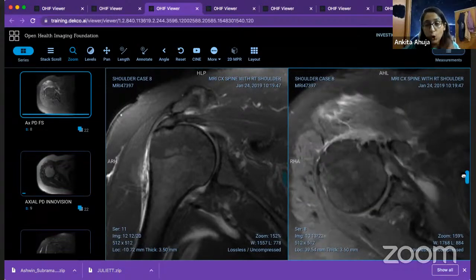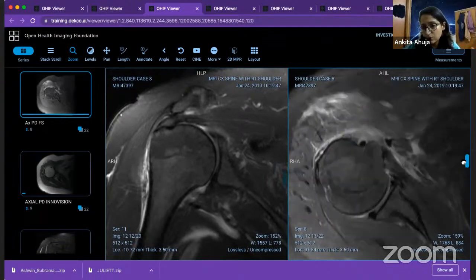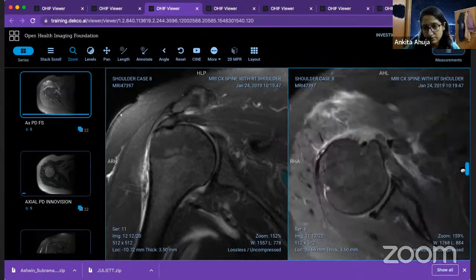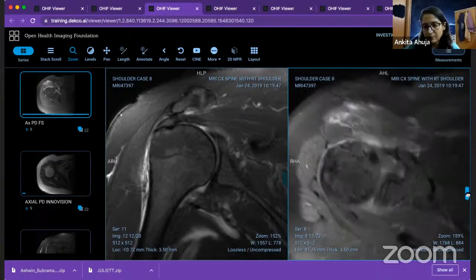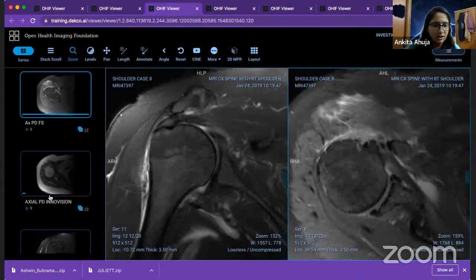What else? So always remember two things. Calcific tendinosis or tendinitis is the most common cause. And the second thing is, if there is some old trauma, there might be myositis ossificans, right? But around the shoulder, calcific tendinitis is pretty, pretty common. Now if you carefully look, this thing overlying here is your calcium blob in the subscapularis. So you have calcium blobs. These are something extra, right?